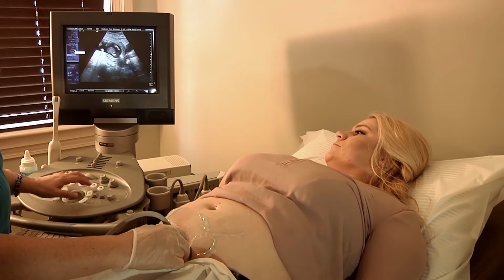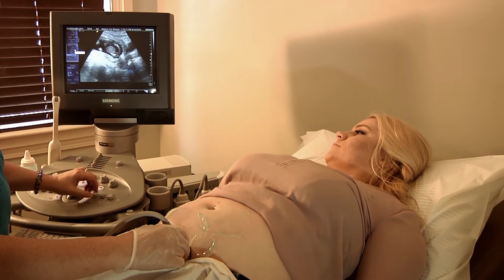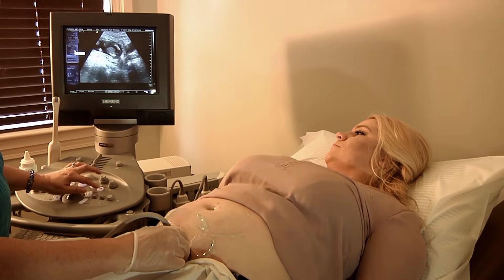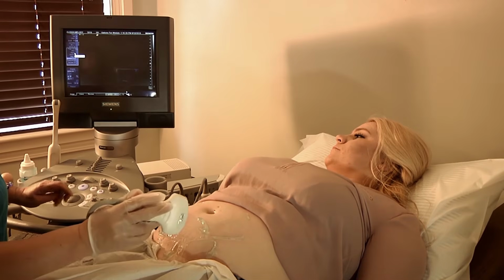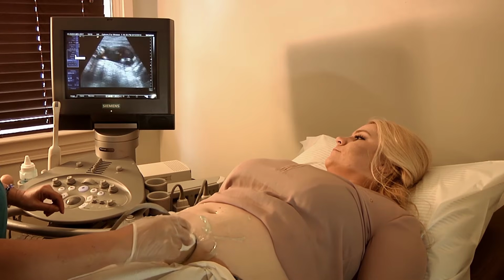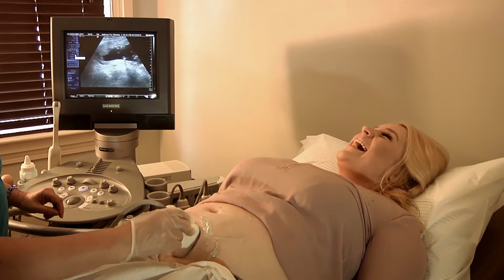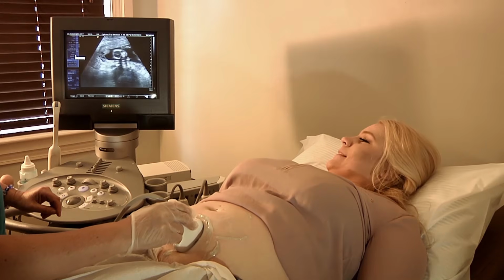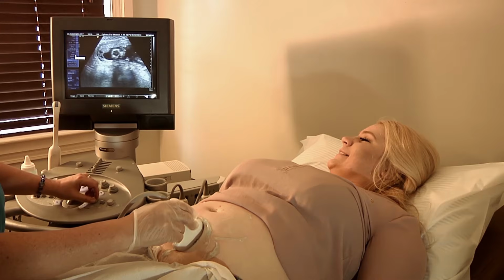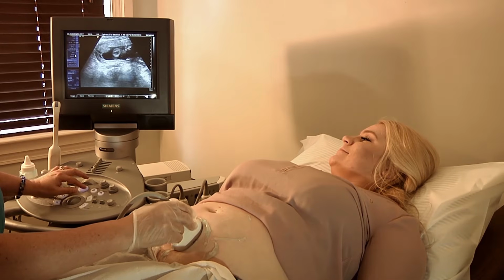Oh, that's gorgeous. I could make it just a tad bigger there. Perfect, because she's 2 fingers, and here's her cervix. She's got a little bit of bladder. That was gorgeous. Okay. And let's try the upper now. Oh my gosh. The baby just kicked against my thing. Oh, skeleton. Hi, Lisa. Here I am. Peekaboo, I see you. So that's the fundus, okay? So everybody see that, okay?